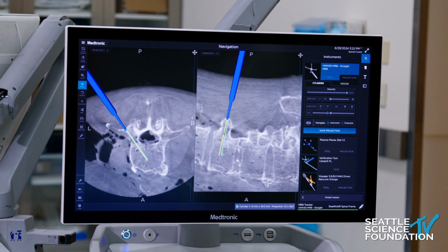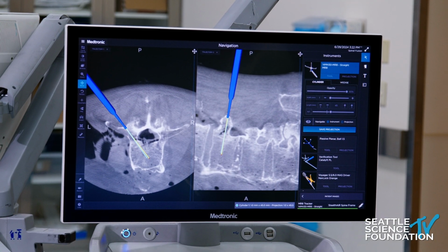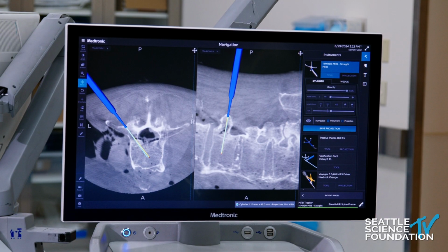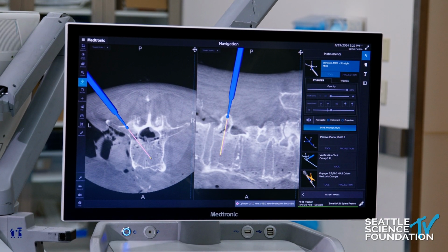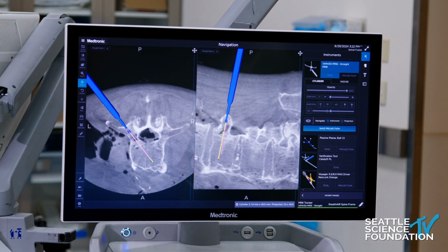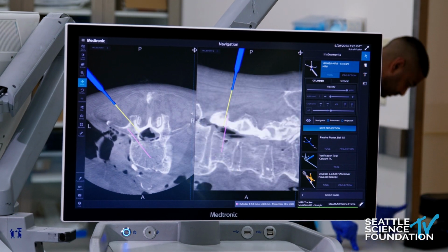the entry point. So can we mark this here so I can find this? You can even go deeper, I guess, huh? So, yeah, 20 millimeters. Wow. Okay, so we can do that. I like it already. Okay, now we'll come out, so we mark that.